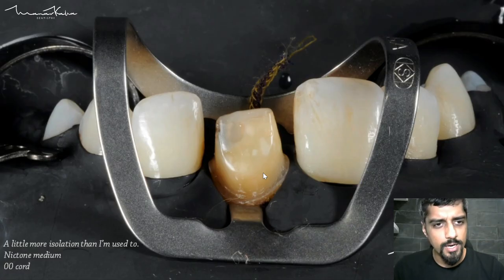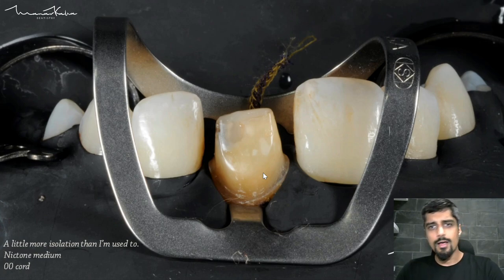Coming to the bonding part — obviously I'm using a rubber dam here. Bonding a single crown doesn't always need a rubber dam, so if you're going to follow all the other steps minus the rubber dam, that's also absolutely fine and correct. One thing that you can do is use a retraction cord — it makes life a lot easier and clean-up becomes a lot easier.